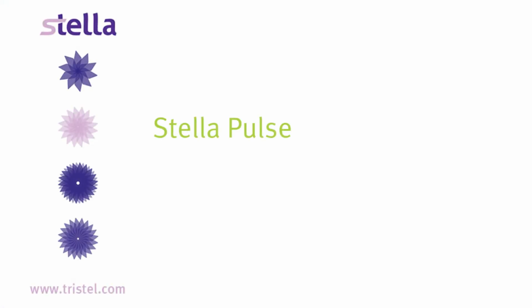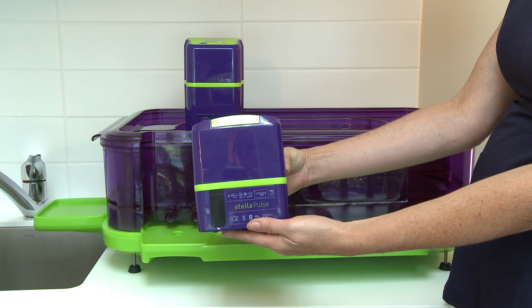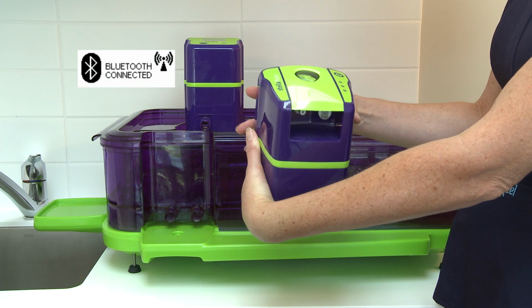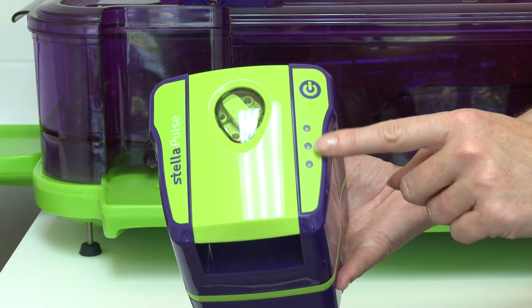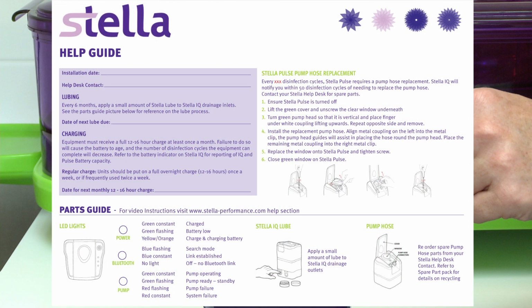Stella Pulse. Stella Pulse is a battery-powered pump used in the disinfection process of non-lumen and single-lumen instruments. Stella Pulse is directed and controlled by Stella IQ through Bluetooth communication. Stella Pulse has one on-off button and 3 LED lights indicating power, Bluetooth, and pump activity. These are explained on the Help Guide wall chart.